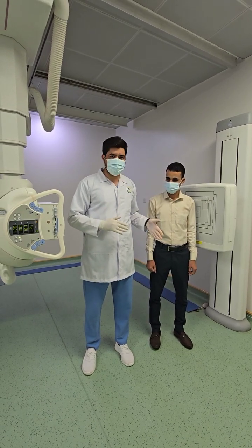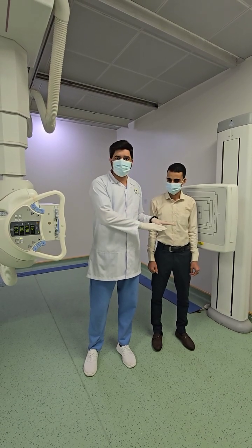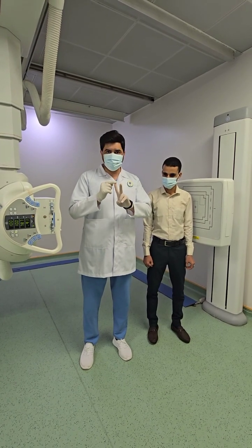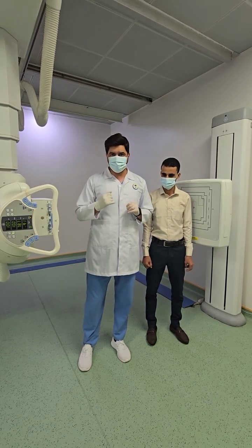Standing, like we are in a standing position, this is erect. Another way, if we sit a patient on the table or on the chair, this is also erect position. So erect has two: one is standing, the other is sitting. Okay? And the decubitus position we will cover in the next lecture.